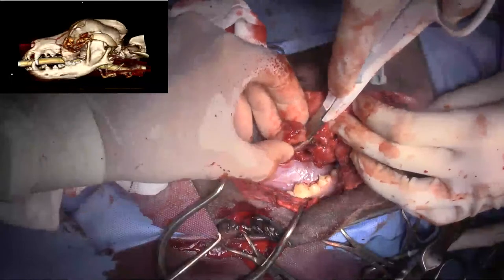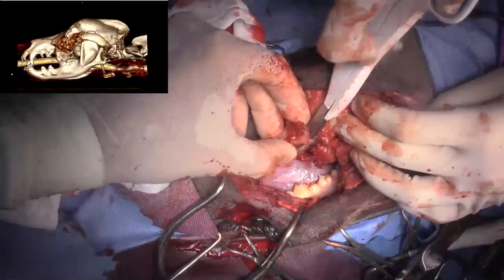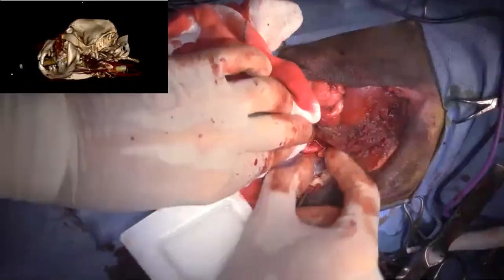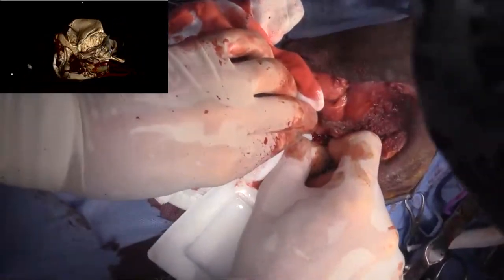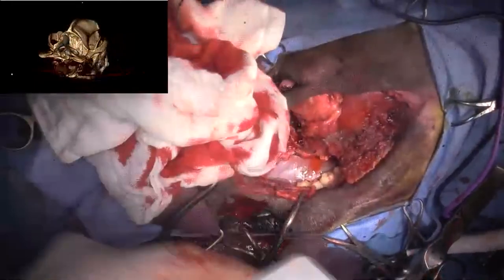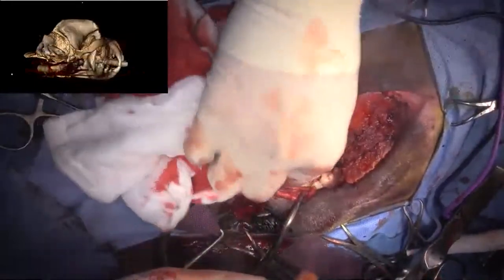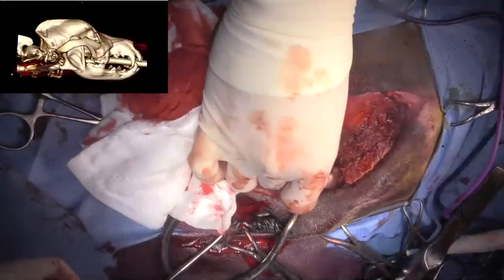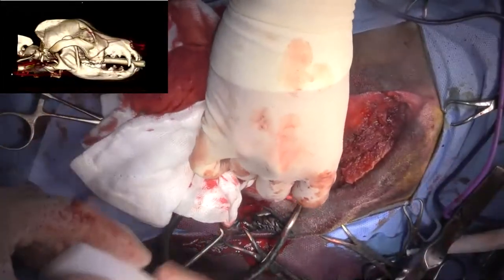Somebody just said, I'm going to refer these. Good idea. Yeah, they get kind of hairy in there when you're in the middle of them. I'm just bleeding from the nasal cavity now. Yeah. A bit from the palatine. Yeah.